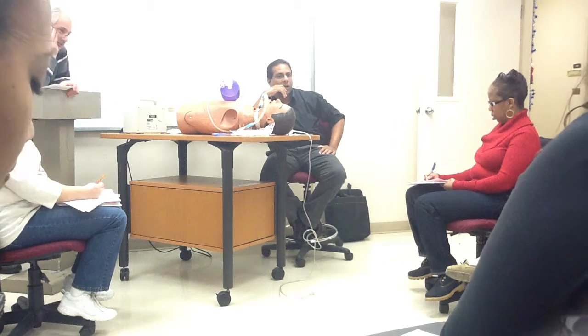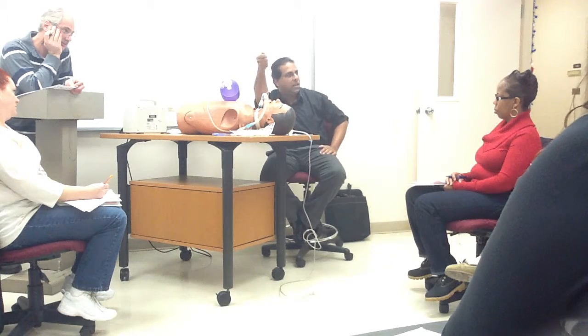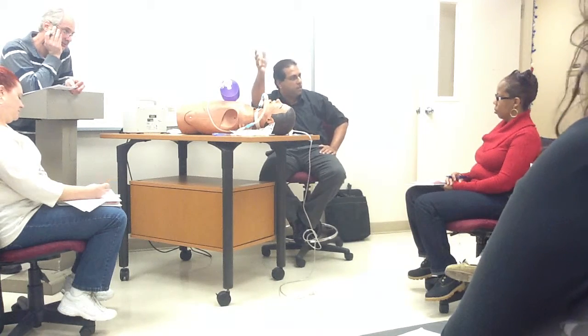So either way, if they can't take a deep breath, then you do that. Yes. Okay. That's what we do. We don't actually go in there and bag everybody when they suction. If they're on trach collar, we ask them, can you take deep breaths? They'll say okay. Then we just turn that FiO2 up to 98% and ask them to take deep breaths for about a minute or so.